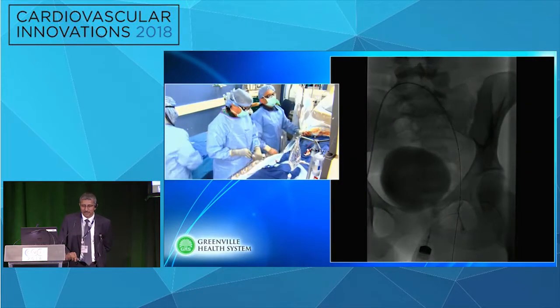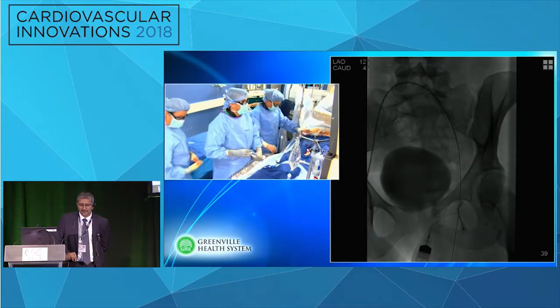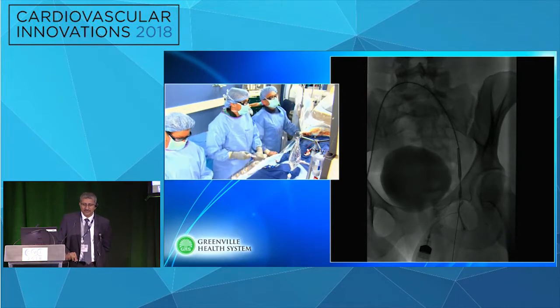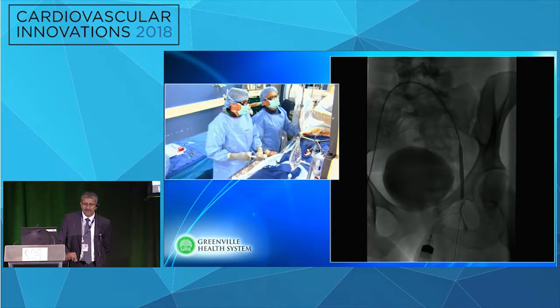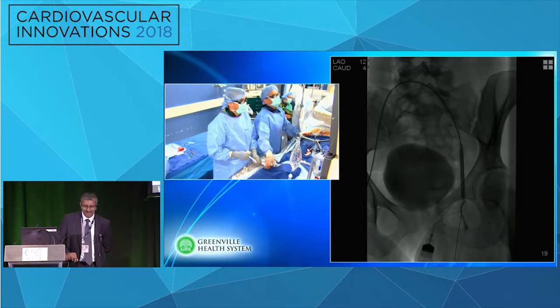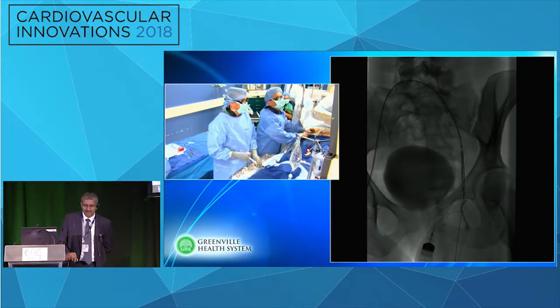All right, we just got a 6mm balloon here. So just kind of see how this looks with it. Just up and down. We're just going to go up to 8 atmospheres of pressure, bring it down, see if we can make a channel here. This is really, for not being a very old occlusion, mean.